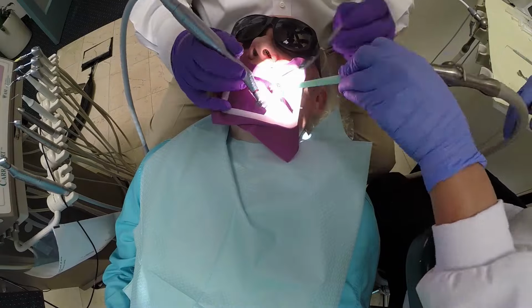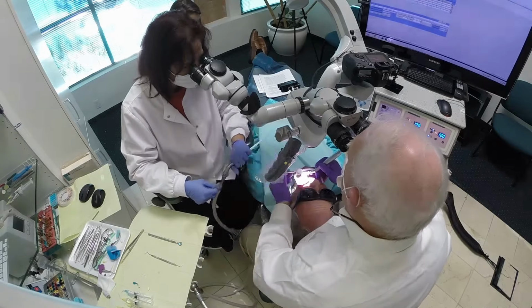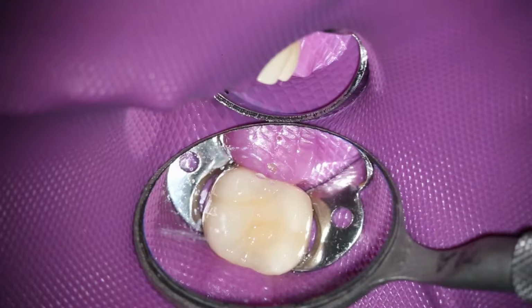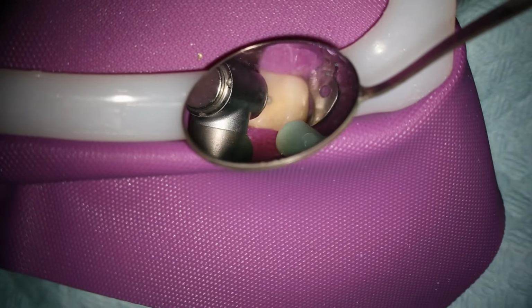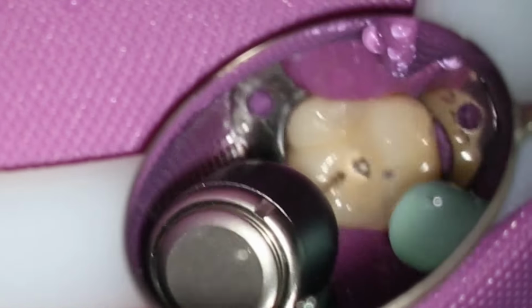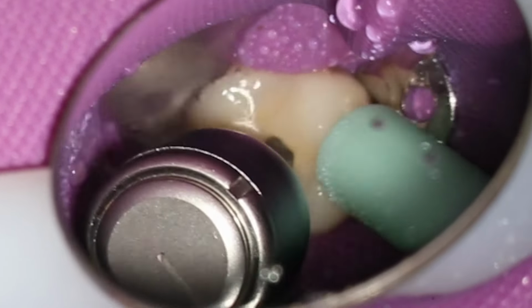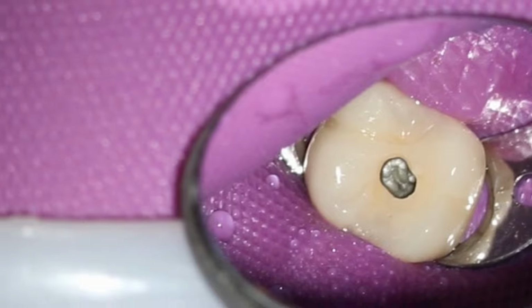I'm going to go through this quickly, and you can kind of see where the mirror is. It's down near the bottom of the dam, and then Joy doesn't have to be sitting there with the Strop-Go constantly cleaning. So the dam is on. That's what it looks like close to the tooth, but down near the bottom of the dam, now I can make an access, and I can do this very accurately, and the mirror just isn't getting dirtied by the handpiece. And here again, plenty of water. The assistant is right there suctioning, but she's free to do other things while I'm doing this. She's not stuck keeping my mirror constantly clean.